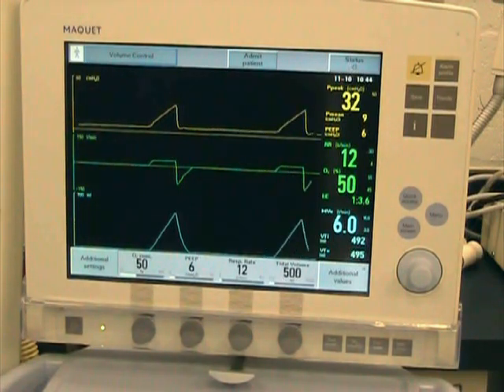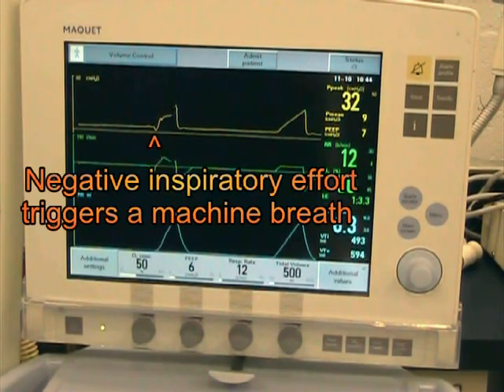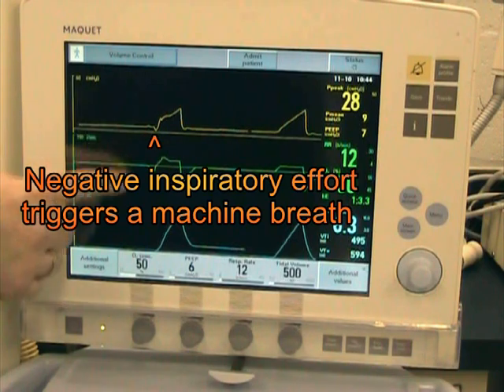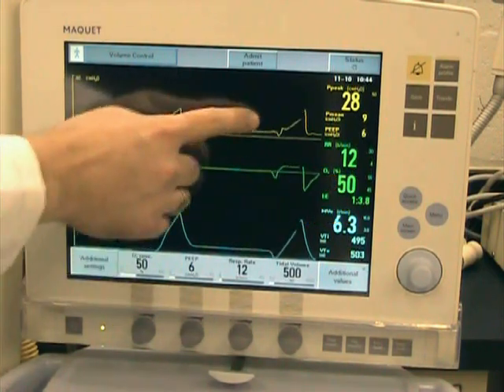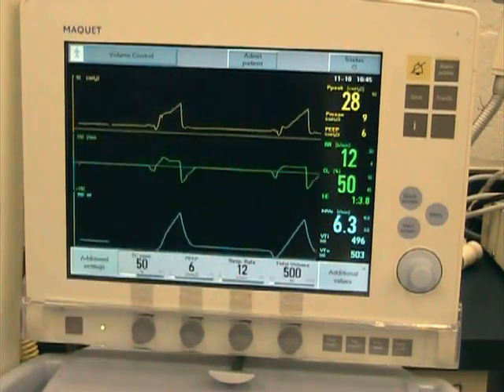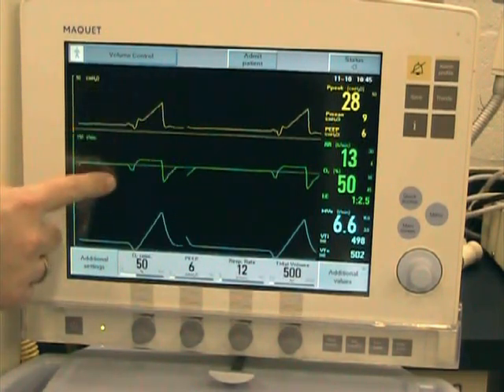In this case, the ventilator is set on pressure triggering, and right there you can see the pressure trigger effort, and another one prior to the machine breath.